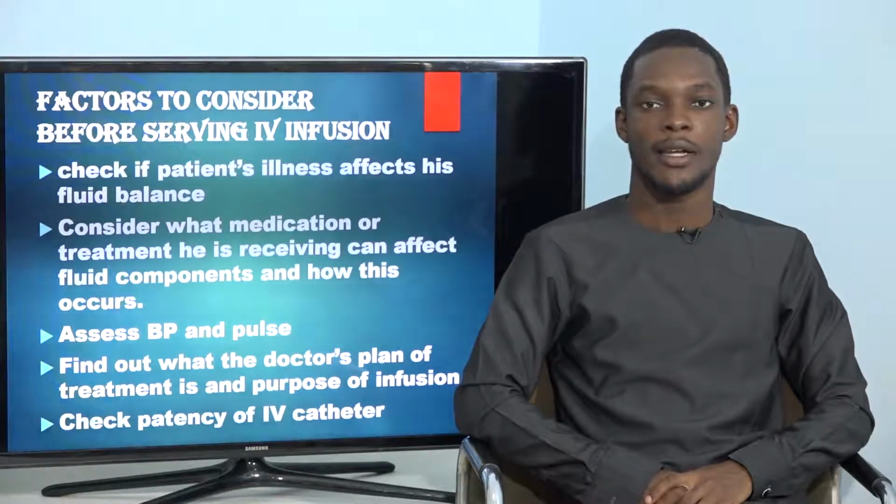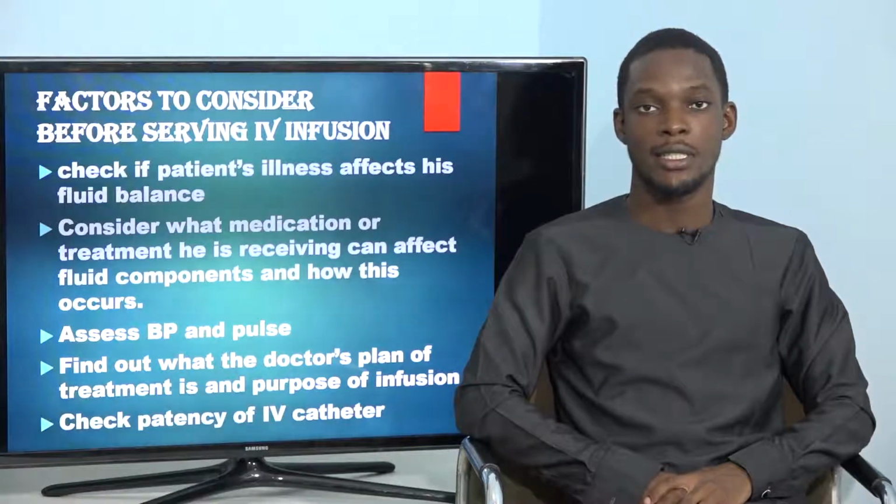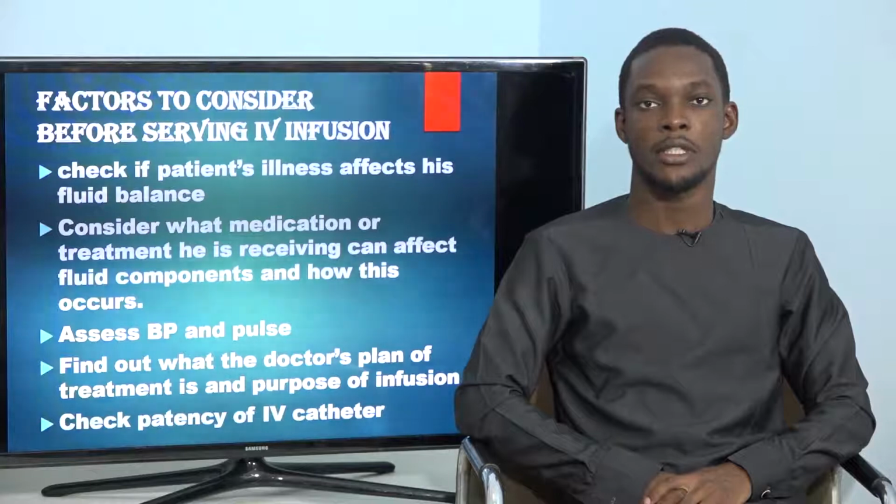Before setting up an IV infusion or before administering an IV infusion, we are supposed to look at the patient's illness and whether it warrants an IV infusion. Secondly, you are supposed to consider what medication or what treatment the patient is receiving, whether it is contraindicated in the infusion or whether it helps the infusion or whether it is necessitated in the administration of the infusion.